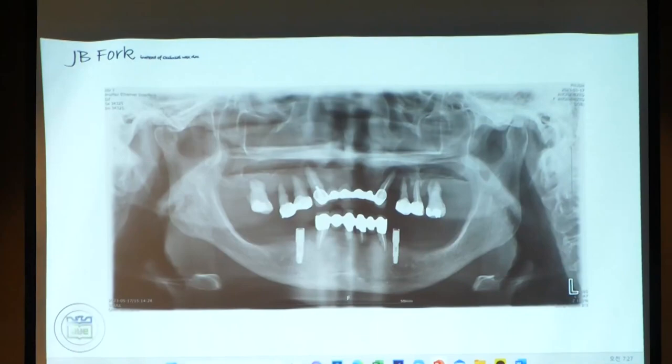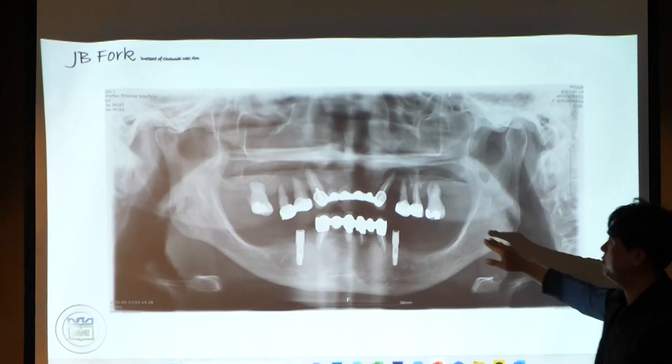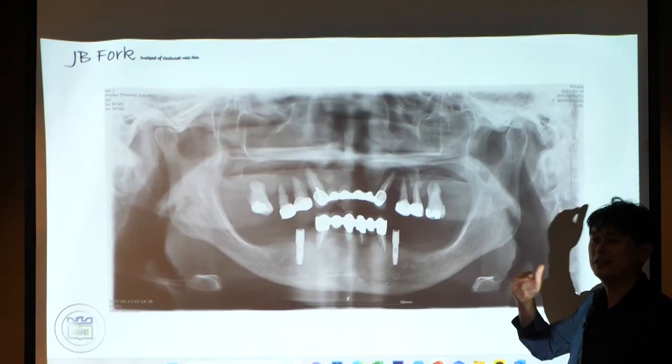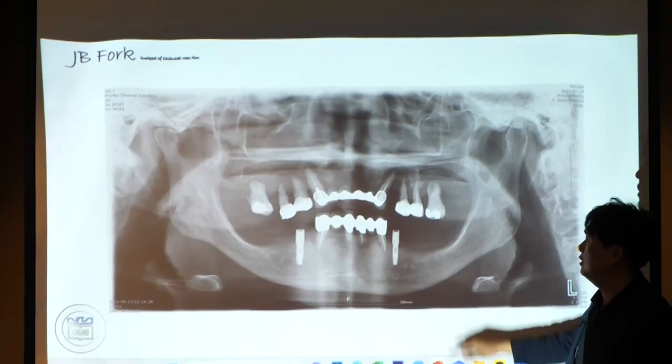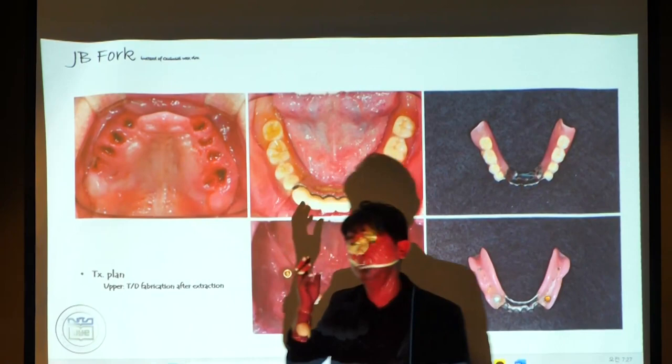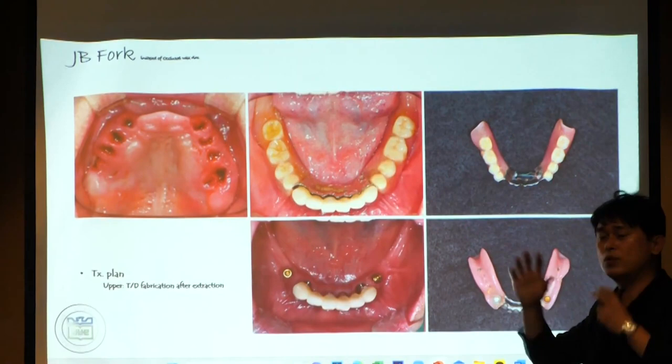This patient has severe periodontitis like this. Her age is about 50. She is a saleswoman, so she needed teeth as soon as possible after extraction of the upper teeth. So she visited our office at 9:30 at that time. I extracted every tooth directly because these teeth had severe mobility. So we cannot get vertical dimension information from the remaining teeth.